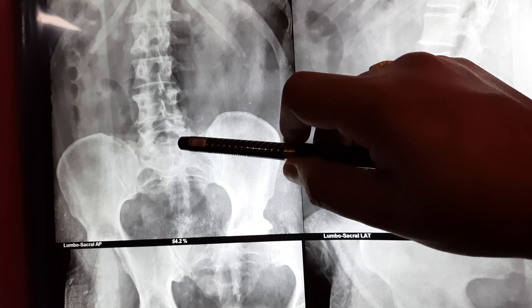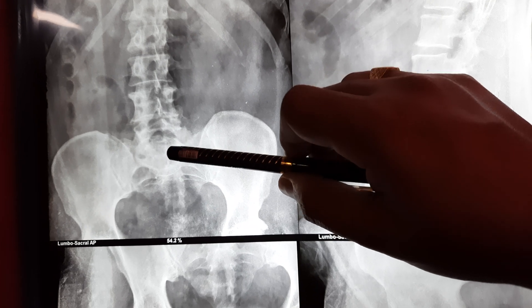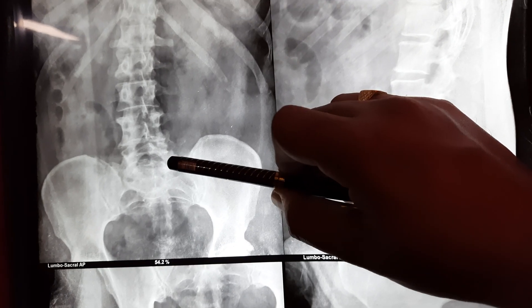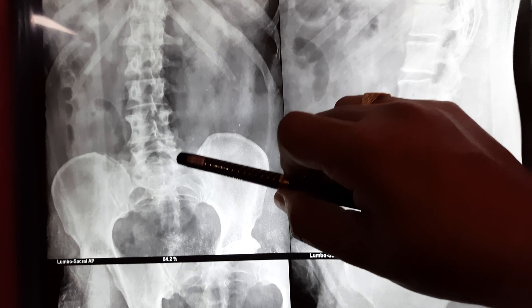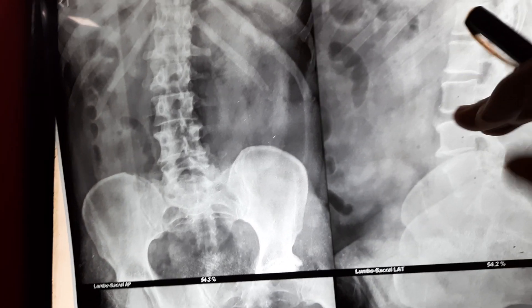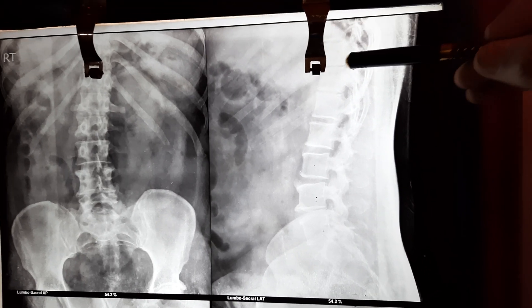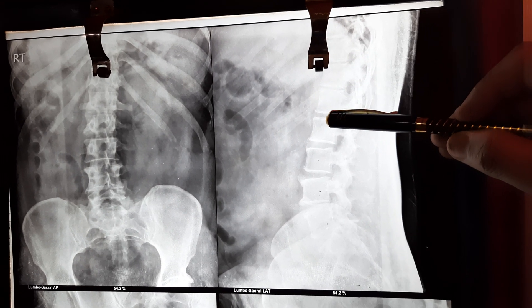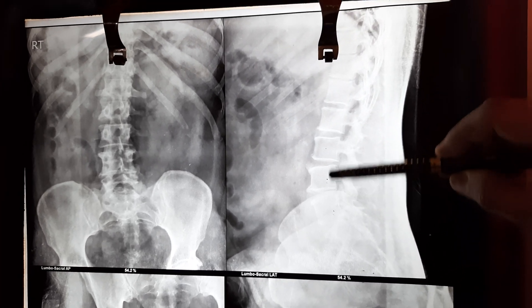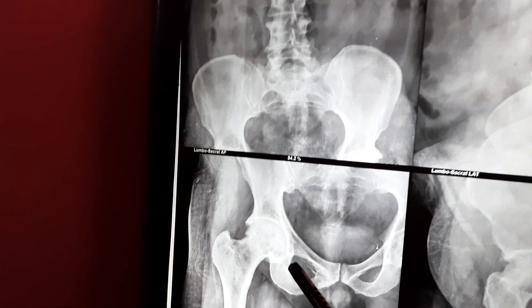We can comment that there is a mild scoliotic change at L5 — that is the first curvature we can see in this patient. The patient is having a primary scoliotic change at the L4-L5 junction. Looking at the lateral view of the X-ray, it appears fairly normal with no significant changes except at the L4-L5 junction.